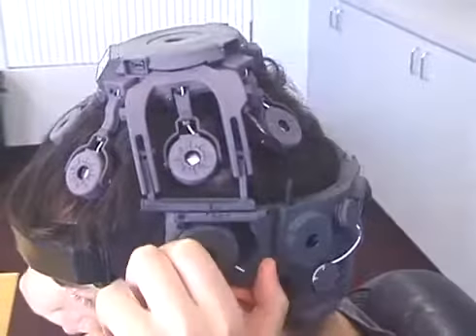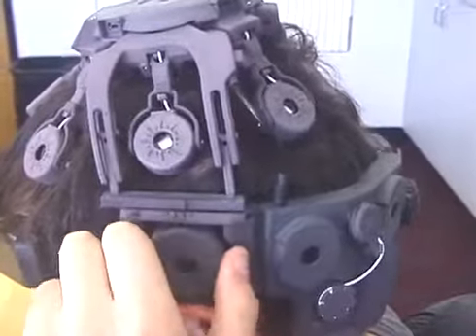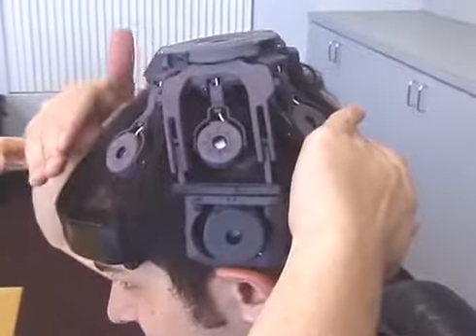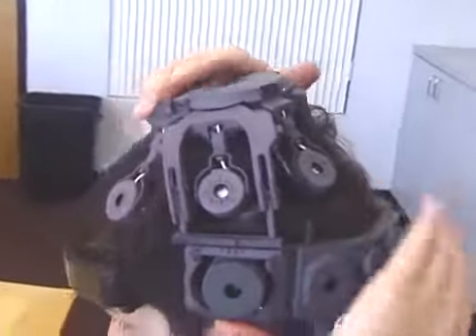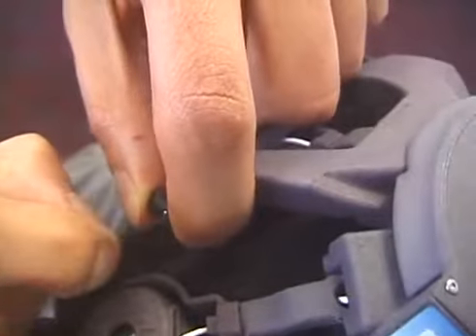Next, move the crown assembly forward or back to align the side sensors with the ear. Make sure the crown piece is positioned so that there is an equal space above the front strap and the back. If the crown piece is not snug against the head, adjust the tension in the elastic on each side of the crown assembly.